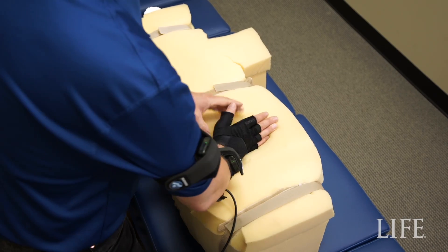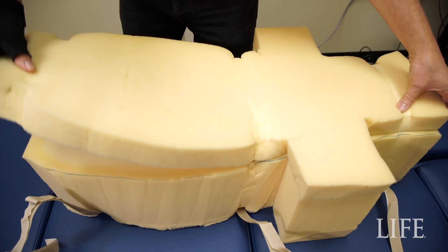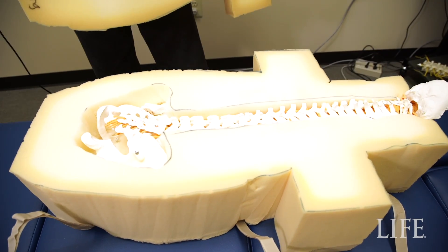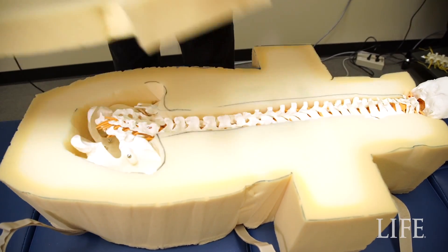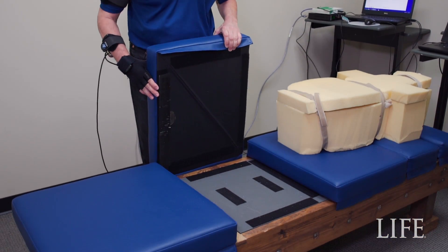First off, this big block of foam we call a mannequin. It's a little bit crude as a mannequin, but it does have a plastic spine inside. This looks like a normal chiropractic table. It has a force plate inside.